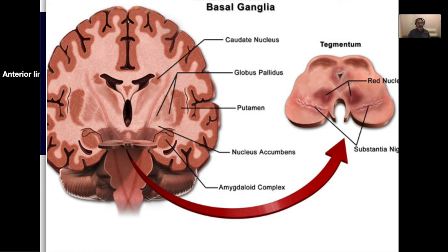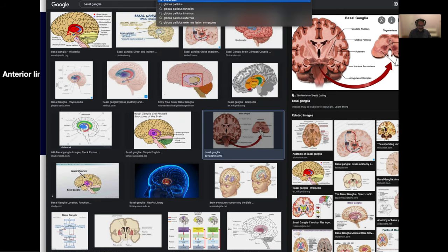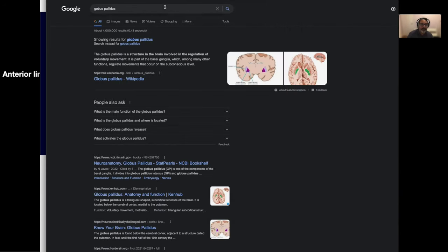So this is, yes, you should know it's there. And in certain MRIs, it's very obvious. In this one, it isn't. Absolutely. Yes, that's where it starts. So globus pallidus. Let's just go through it a few times, so you will know where it is.